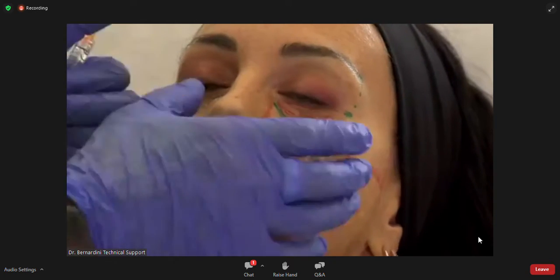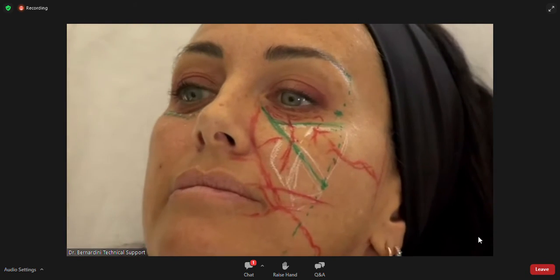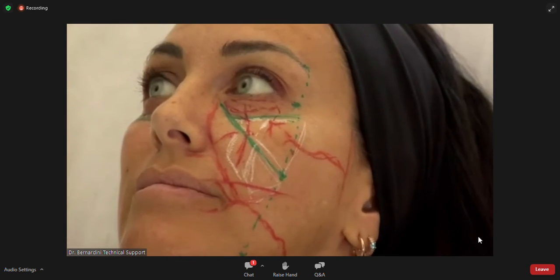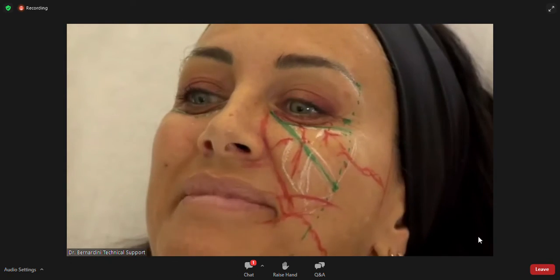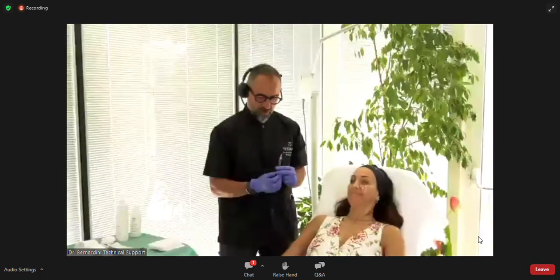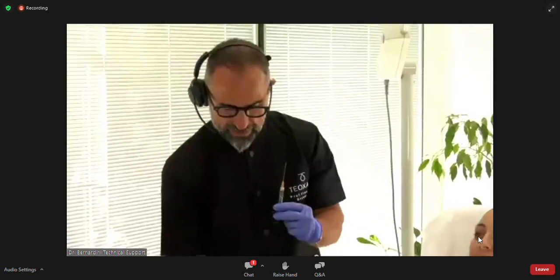Okay, so I didn't even look at how much he injected. Give me the camera because I want to show you that in the meantime. I'm going to give a break to the patient, but we are at the time where we'll be switching products.